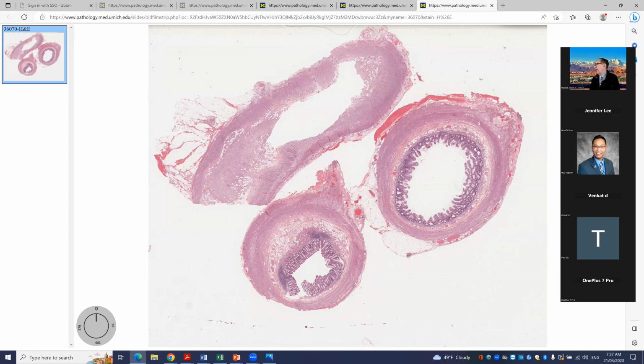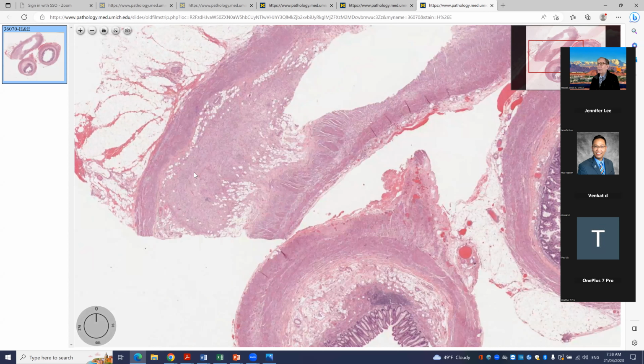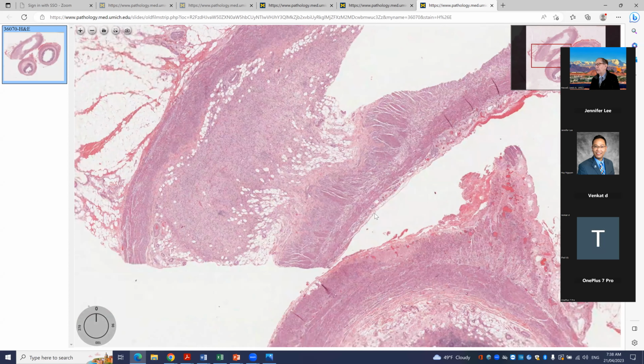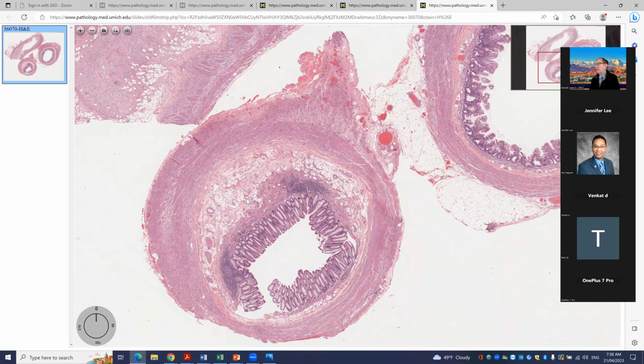This is a 50-year-old man who has a right-sided colon cancer. And so they've resected the colon and you section the appendix. And here we see that the distal portion is all fibrosed down. Very little of anything left here, very common finding. But even in that situation, we can oftentimes find pathology in the appendix. And so what do we see here?